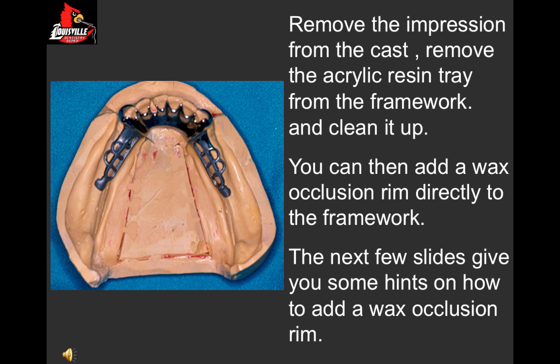You're now ready to remove the impression from the cast and clean it up. Remove it very, very carefully, and there may be areas that are locked and may require some stone work, or removing some excess stone that may be wrapped around your tray, or you run the risk of breaking that master cast, especially in those posterior areas, right around the retromolar pad. Those seem to be the most vulnerable areas.